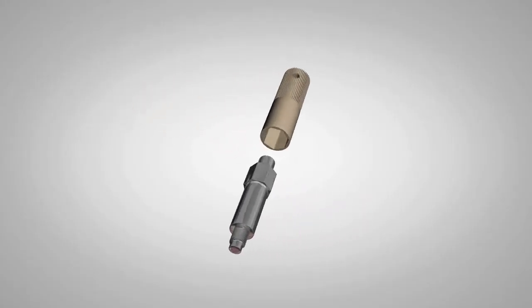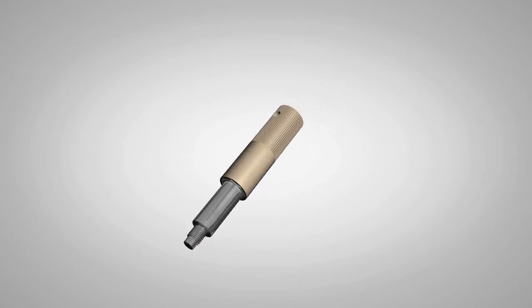The SmartPeg is attached to the implant. It screws effortlessly into the implant's inside thread.